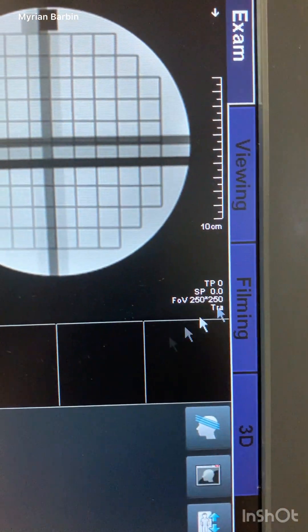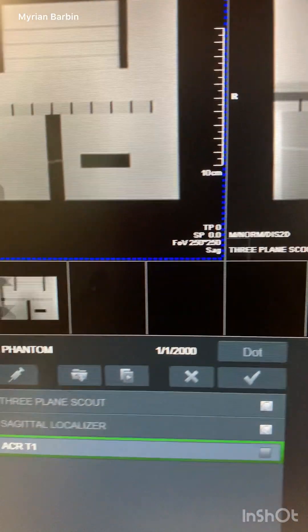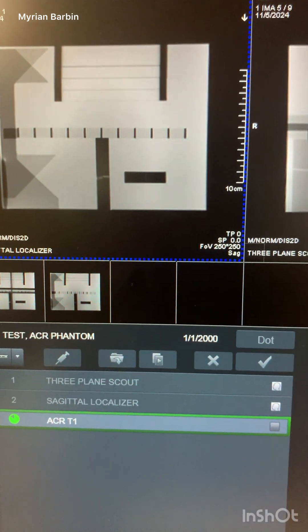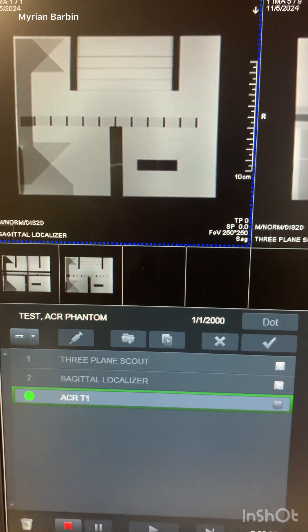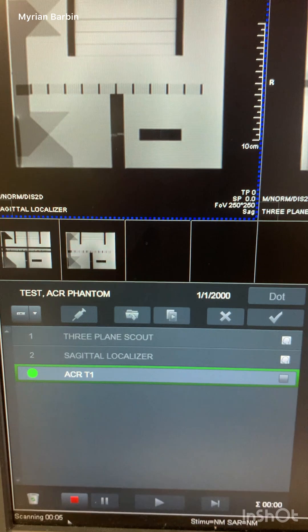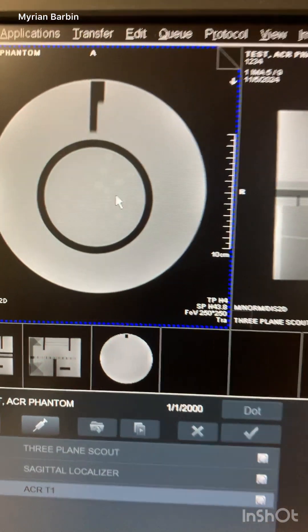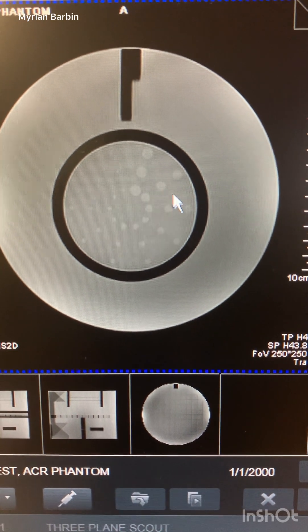Now I'll show you how the images look. On this scanner you have different tabs: exam, viewing, filming, and 3D. You can window and level the images if you want to. Looking at the spokes artifact on the phantom image, I can see about 10 spokes.